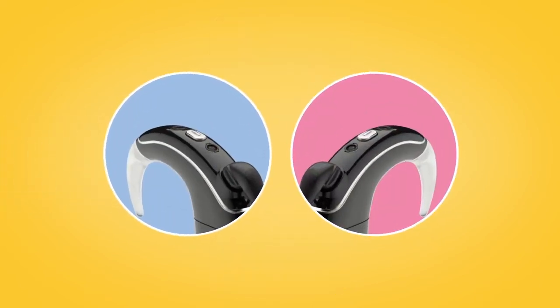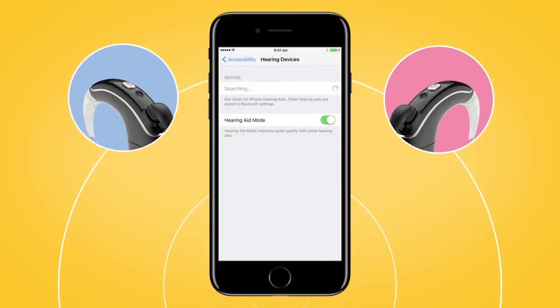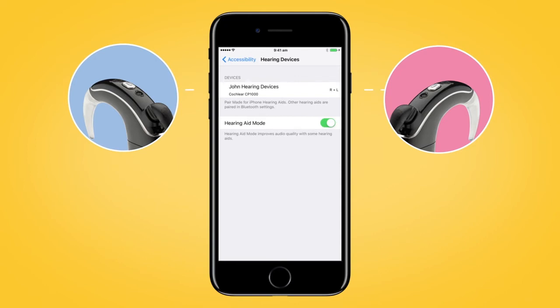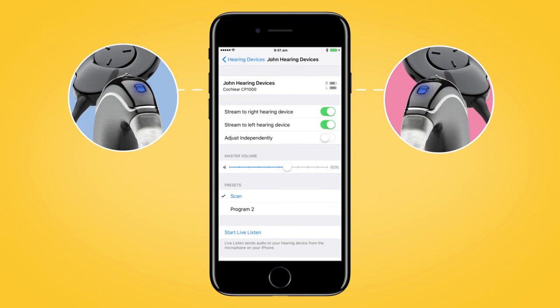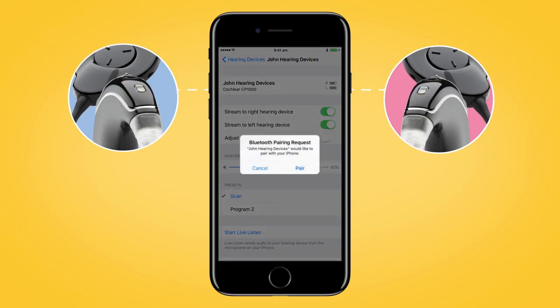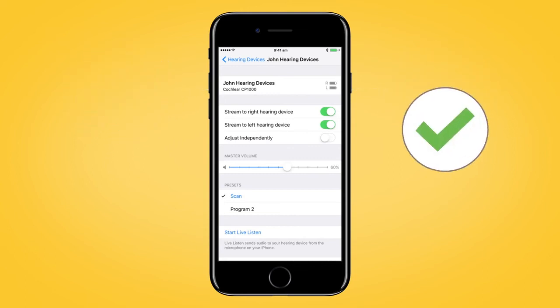If you have two sound processors, both need to be paired during the same pairing window. To do this, turn each of your sound processors off and back on again. Your compatible Apple device will search for your sound processors and display them as a pair here in the Devices section. Select the name of your processor and then tap Pair for each side to begin pairing both your Nucleus 7 sound processors with your compatible Apple device. Make sure to confirm pairing is finished as previously described for each processor.